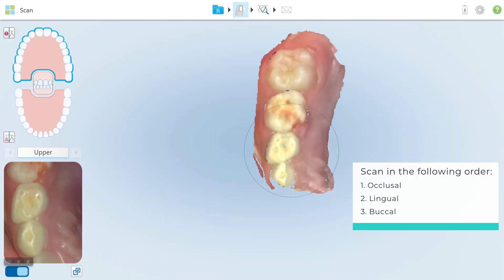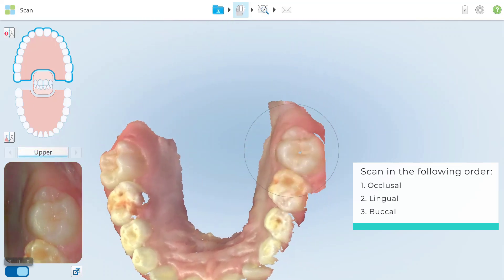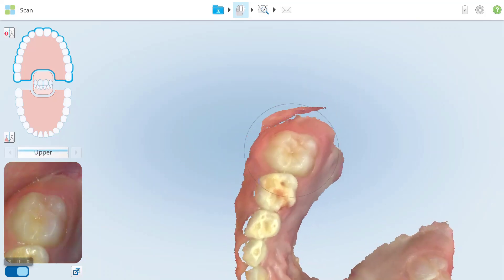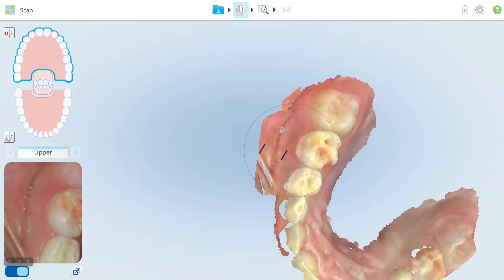Make sure to fully capture the upper arch definition before scanning the palate. Ensure that at least 3 mm of gingiva tissue above the posterior teeth is captured from the gingival margin or from the cemento-enamel junction line.